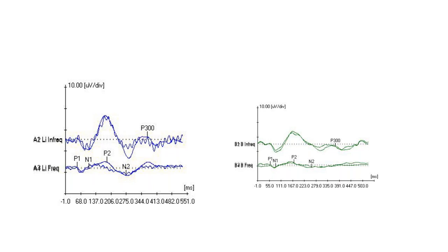The theory I believe in ANSD and cortical evoked potential is that basically it helps us in knowing the severity of desynchrony. Because we all know that in ANSD, what is lost is synchronous firing. For ABR, we require highly synchronous firing. Cortical potential requires less synchronous firing. So what I believe is that if both cortical evoked potentials and ABR are absent, the severity is much more than in a person where ABR is absent but cortical evoked potential is present. That's how I say when cortical evoked potential is also absent, the word recognition score or the speech understanding is much poorer in ANSD compared to presence of cortical evoked potentials. Of course, there are some people who don't believe in this, but somehow whenever I see a patient, it does correlate.